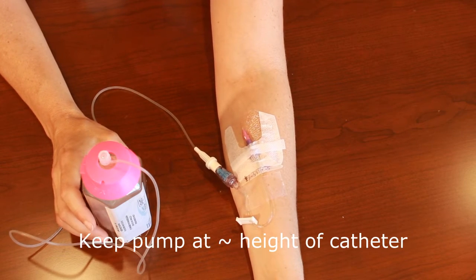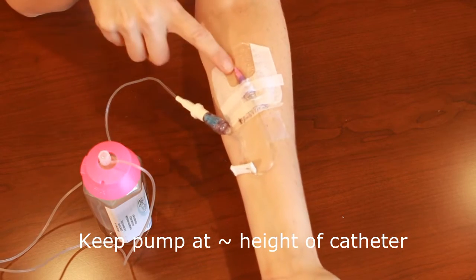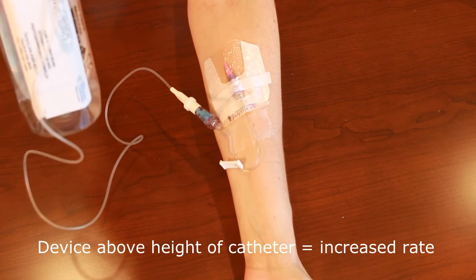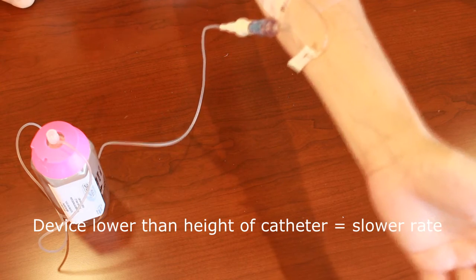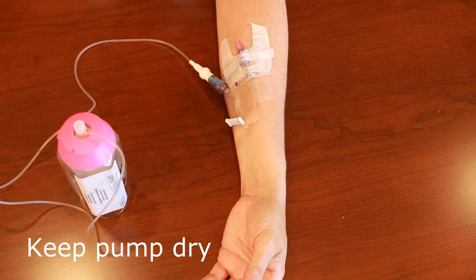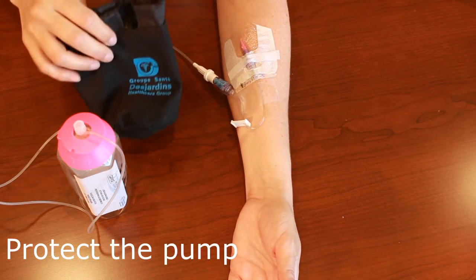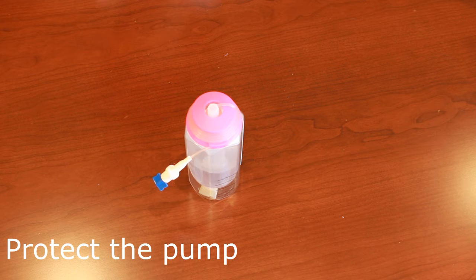Height will also affect the rate the fluid flows. Once the pump is connected to the catheter, keep the top of the pump as close to the height of the IV device as possible to ensure accuracy of flow rate. If you raise the pump, it will run faster by about 0.5% per 2.5 cm. If you lower the pump below the height of the vascular access device, it will run slower. When the patient is sleeping, you can keep it tucked under the pillow. It's important to keep the pump dry — when showering or bathing, place it on a chair outside the tub. Keep the pump in its carrying case and make sure it isn't dropped. It should be protected from light and out of reach of children and pets.